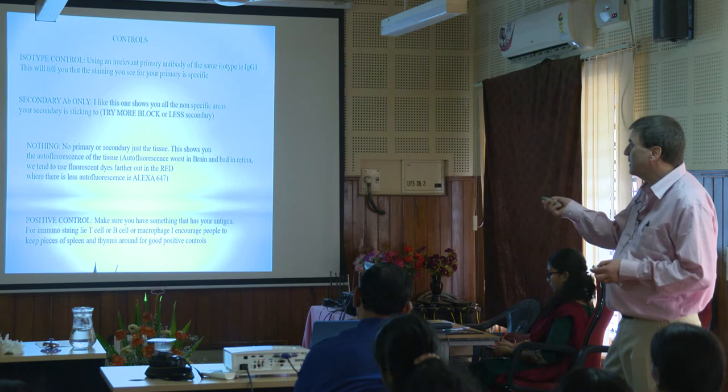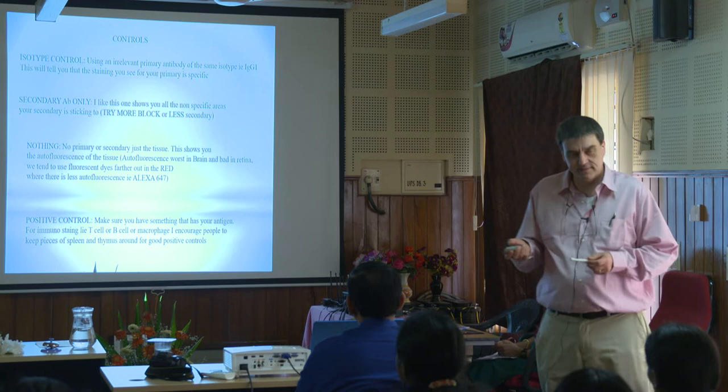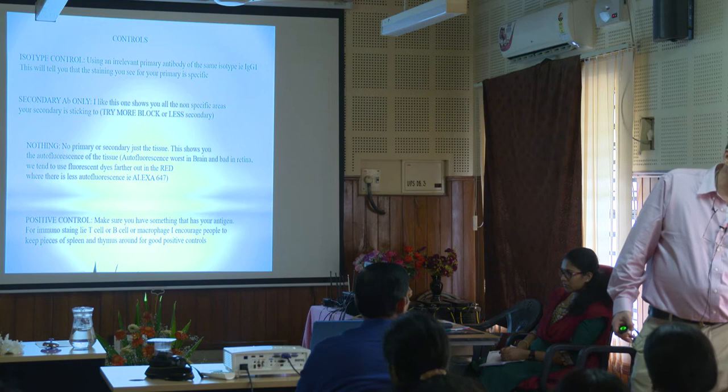So, controls. People come to me all the time and say, oh, did my staining work? And we'll look at a slide and I'll go, okay, where's the control? And they look at me like, what? Did it work? I said, I don't know. I cannot interpret what you gave me without a control.